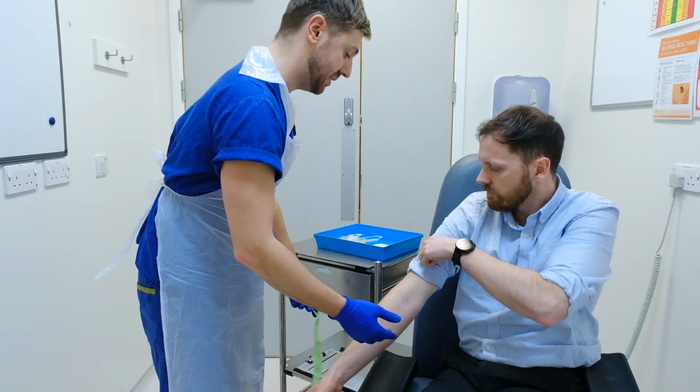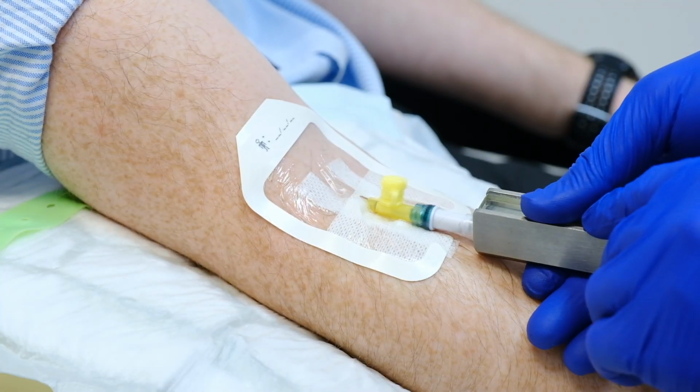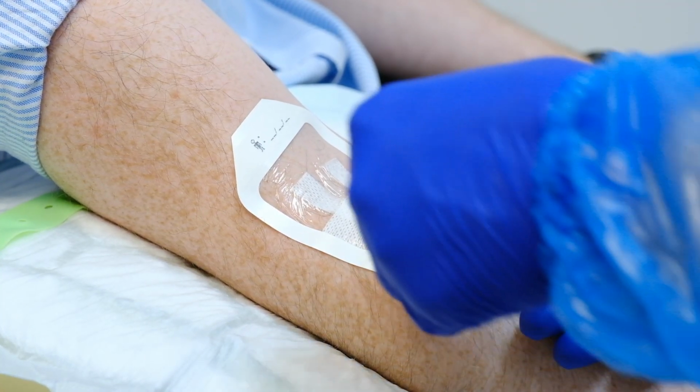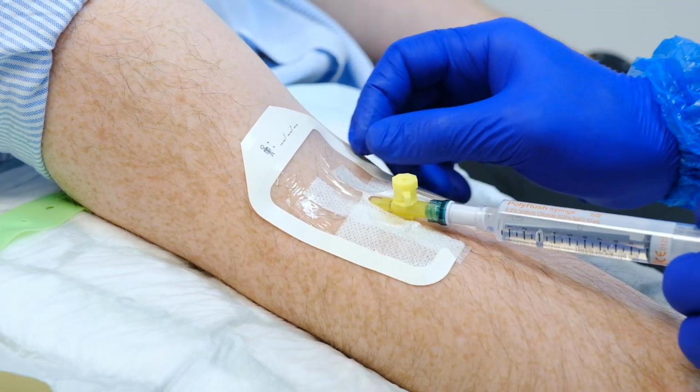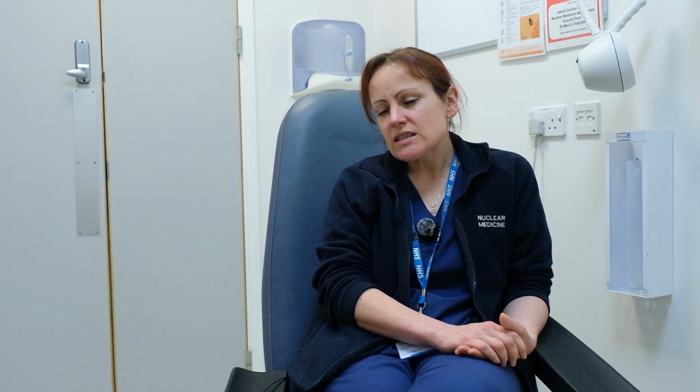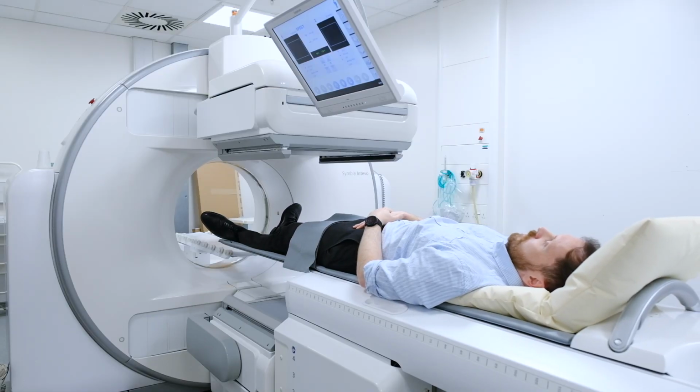We would then pop a cannula into the arm or into the hand, and through the cannula we inject 600 megabecquerels of HDP. We would then advise the patient what time to return. In our department, we give a time 3 hours afterwards. We would also request in that time in between the injection and the scan that the patient drinks plenty of water and empties the bladder frequently, just because it improves the quality of the pictures that we give.